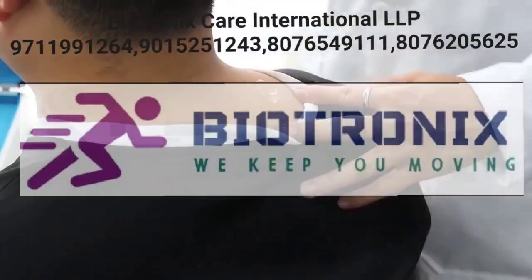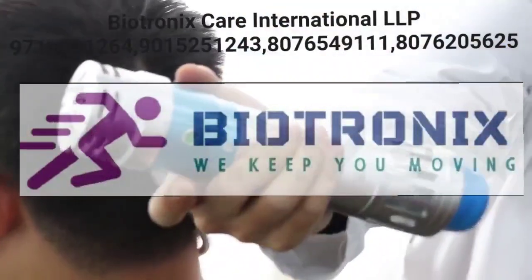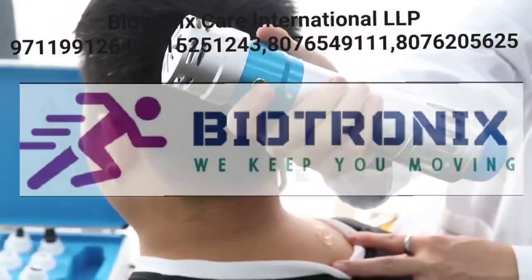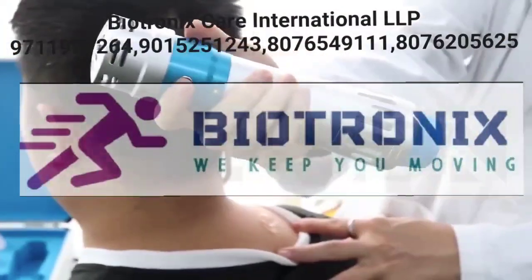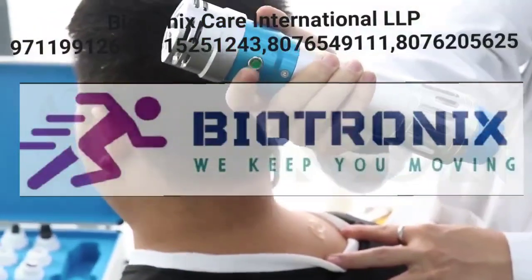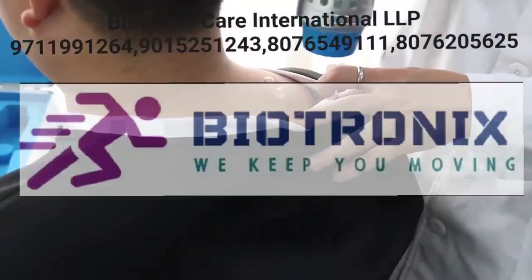And thirdly, you will see this is a handle. It's more flexible. This is a hand control to the operator. You just press the button. It will start the treatment. You will see press, start, press, and start again. So now we can start. We can press the button.